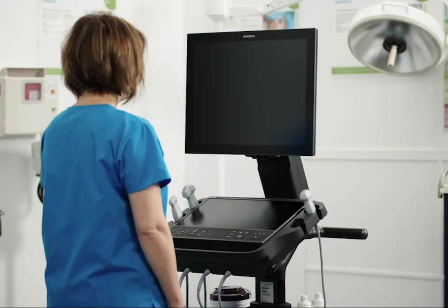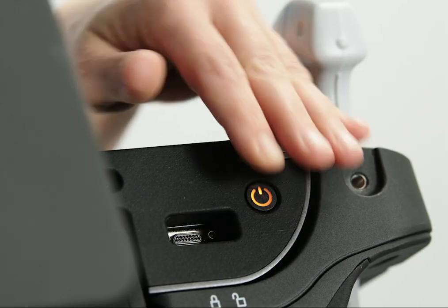To turn the system on, press the power button. The system will beep to let you know it's starting up.